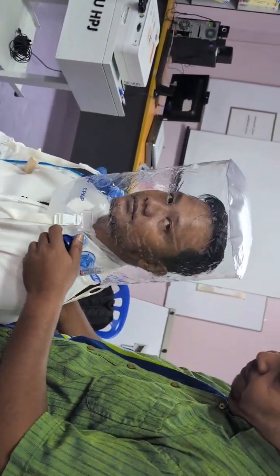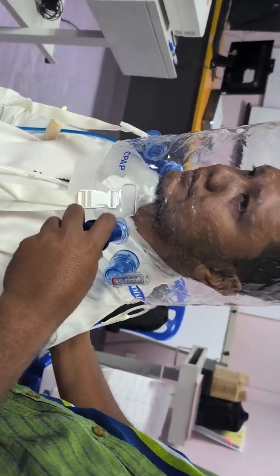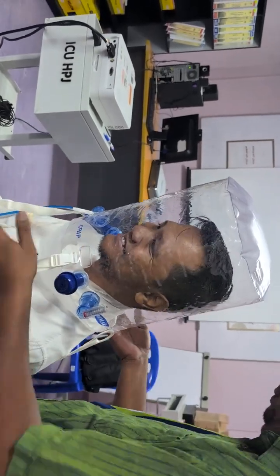Breathe in, breathe out, breathe in, breathe out. I'm going to increase the PEEP, okay? I'm going to increase the PEEP. Okay, more?